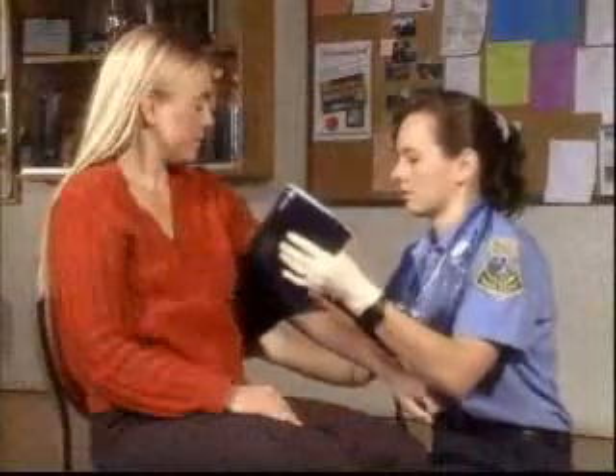Before you begin, be sure to note whether the patient is sitting, standing, or laying down during the pressure reading. The standard position is with the patient sitting, with the patient's arm relaxed. However, this position is not always practical in an emergency situation.